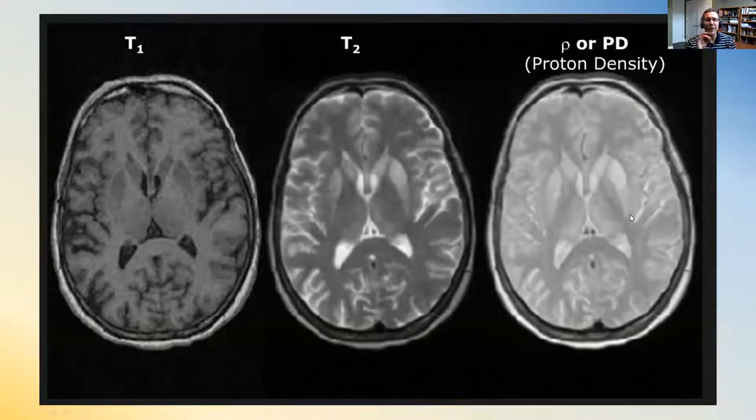One of the greatest things that MR is used for that X-ray CT is not used for at all is brain imaging. It's one of the most common modalities for imaging the brain. And the cool thing about MR is just by changing the parameters of your conditions, you get images with different contrast. Like what I'm showing here is the exact same human's brain and the same slice through the brain, but you can see that the colors are different in every picture. And that's because the technician is able to change some of the conditions of the experiment to highlight certain types of structures. So for example, over here, you can see this beautiful structure inside the brain. Over here, you don't see those structures quite so much. They're looking at different things. So depending on what the physician or radiologist or pathologist needs to see, they can tune the experimental conditions to bring out the greatest amount of contrast in their image.